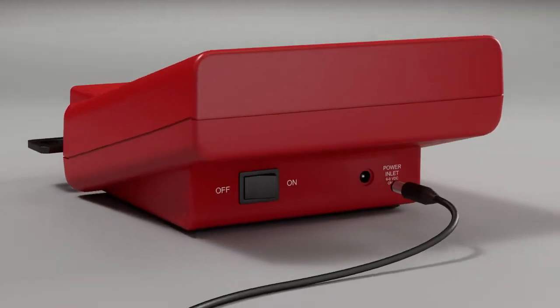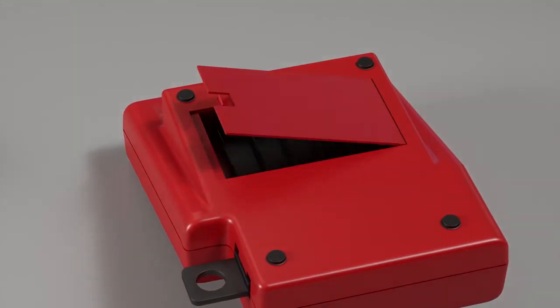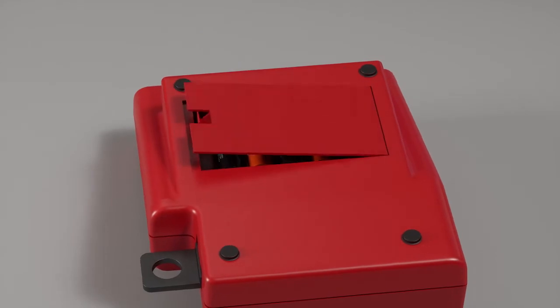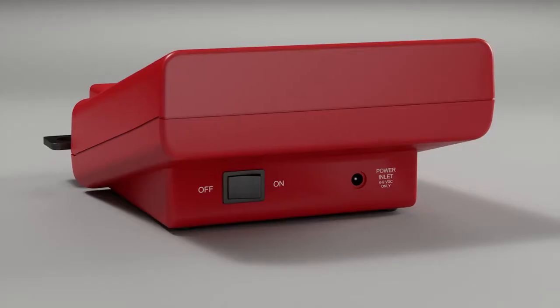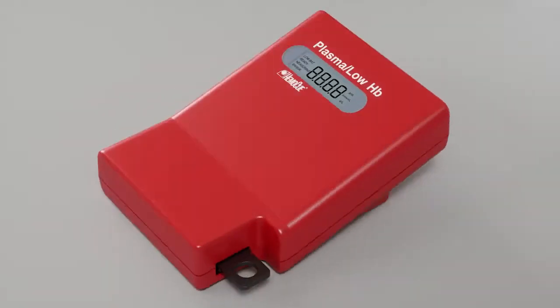Connect the power adapter to the power inlet or insert five type AA batteries, 1.5 volts. Do not store batteries in the battery compartment when using the power adapter. Start the photometer by turning the power switch on. All symbols will be displayed.